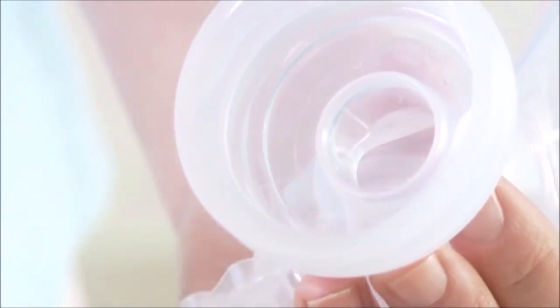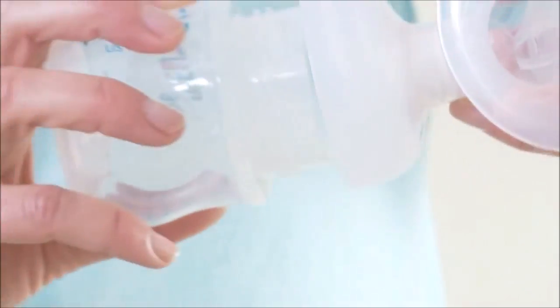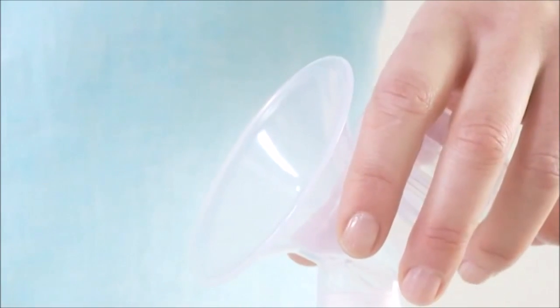Insert the white valve into the pump body from underneath and push it in as far as possible. Screw the pump body onto the Philips Avent's natural bottle until it is securely fixed.